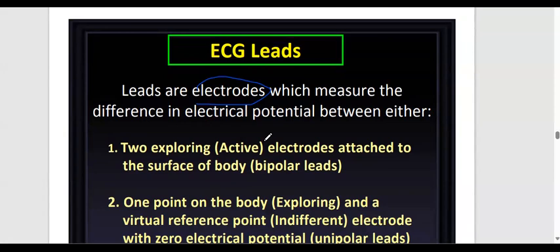When the heartbeat starts, we will get the exact beat and exact electric conduction of the heart. From that area to the upper leads, and from that area to the lower leads, we have to collect the amount of electricity. From that, we will be able to understand whether the electrical conduction of the heart is normal or abnormal, according to the graphical presentation.